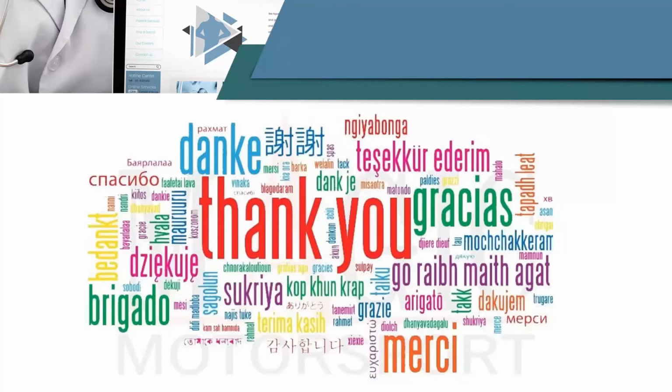Yeah, see, what happens if you don't have an in-house radiologist also. For a CR or DR image, after the processing is done, the image automatically goes into the PACS system. So the radiologist, wherever he's sitting, within the hospital premises or outside, can view the image on the PACS system and then report online. Thank you.